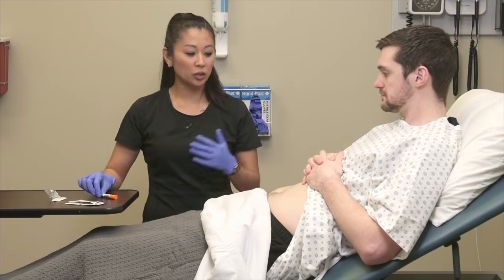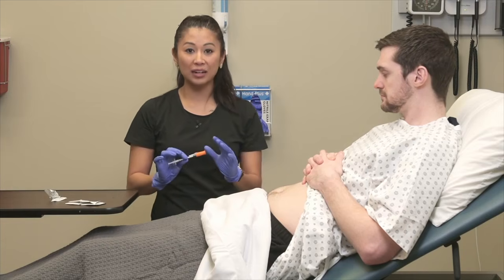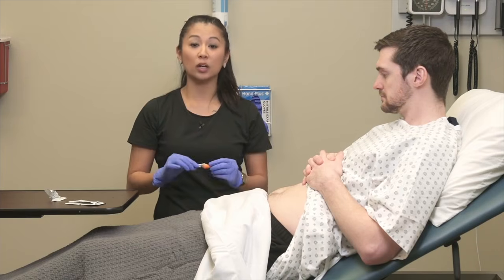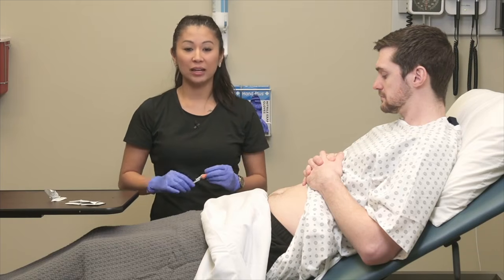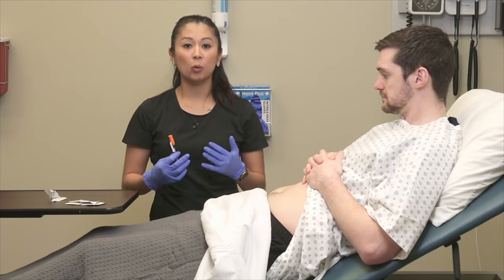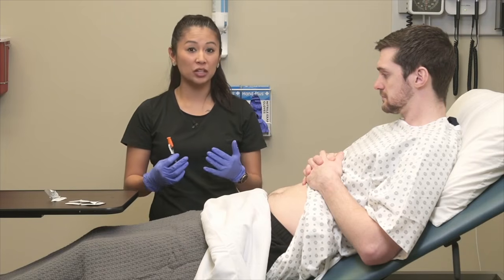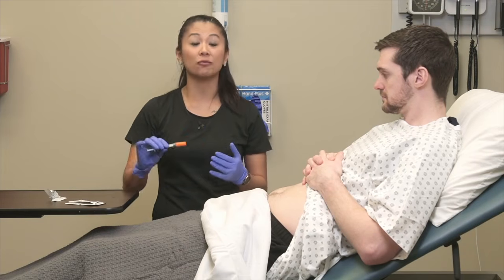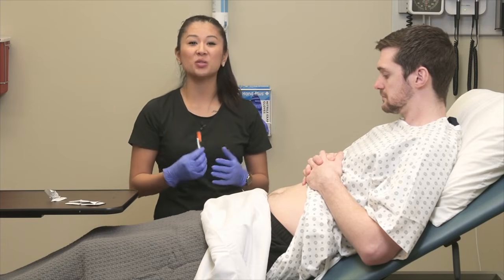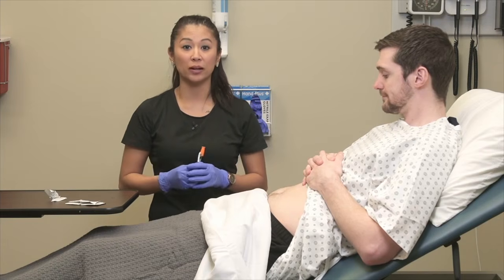All right, so now let's also talk about the angle. Now my patient's at a healthy weight, so here we're going to go at a 90-degree angle. If my patients may be emaciated, malnourished, or have very little adipose tissue, we may need to consider going at a 45-degree angle. But for this demonstration, my patient, we're going to use a 90-degree angle, which is appropriate.